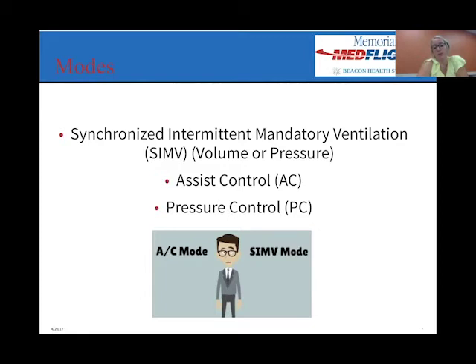And then pressure control ventilation. So instead of setting a tidal volume, you're going to say once the vent reaches a certain pressure, 20 is a pretty normal one, then it's going to shut off. And whatever tidal volume they get with that pressure of 20 is whatever tidal volume they get. It's a different mode of ventilation we use a lot in small kids, and sometimes you see it in the adult world too.